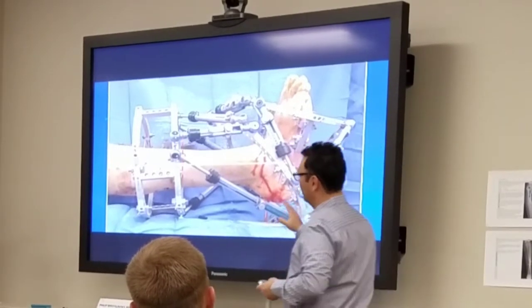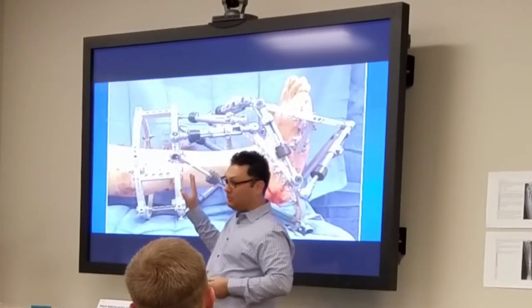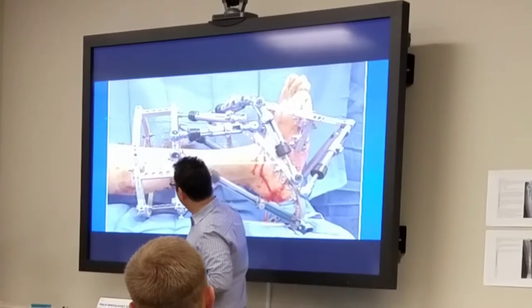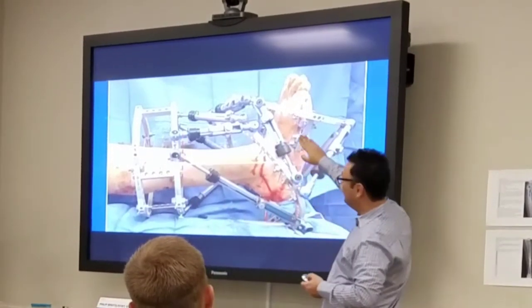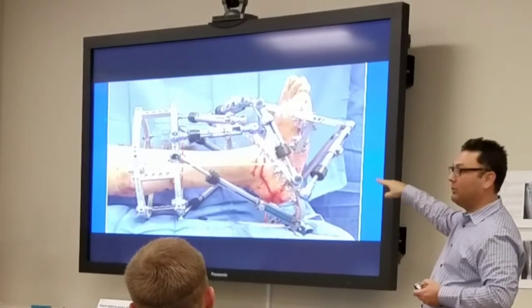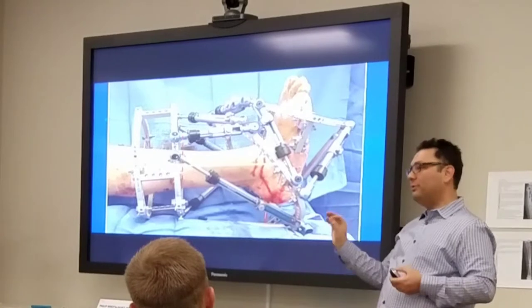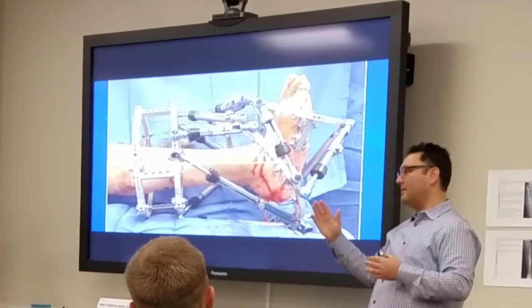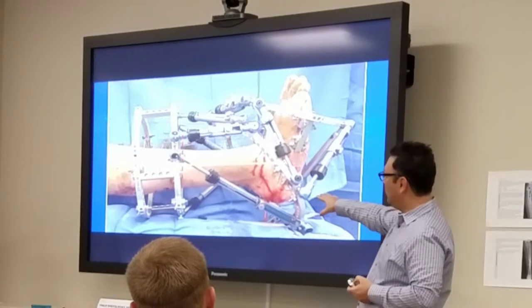When you tell the computer all this properly, and especially with the hex, it's going to even look better. You say it's this amount of distance, I use the subtalar joint, it's going to know based on the strut amounts that you're tilted. The doctor sometimes asks, how does it know that it's tilted? Once you put in those struts, the computer realizes that thing is tilted, and adjusts for that. Okay? That's your equinus correction.